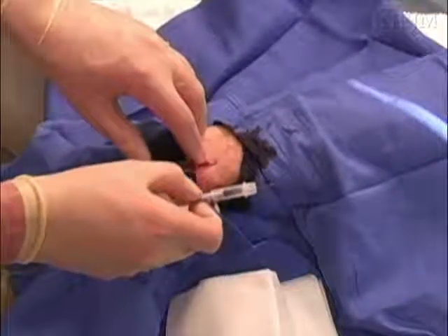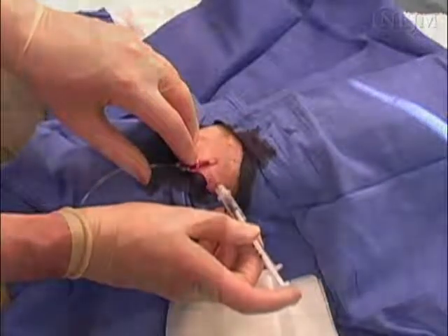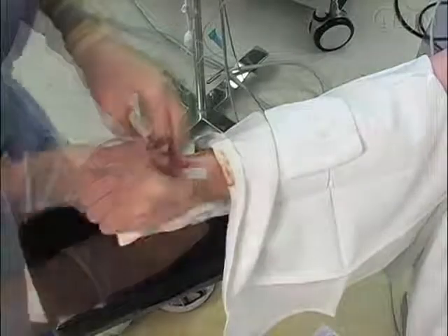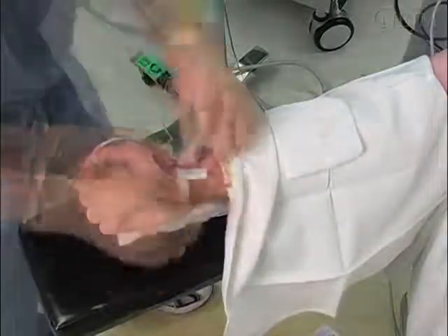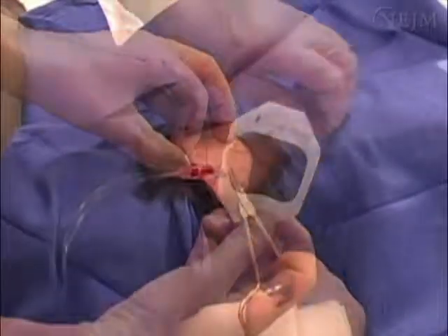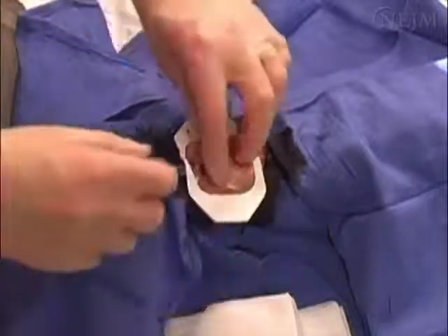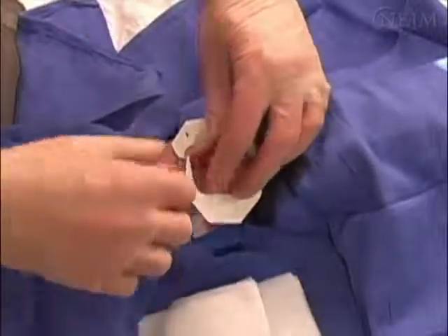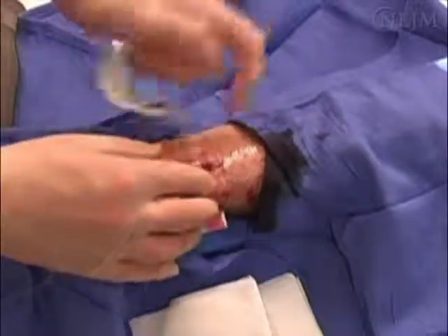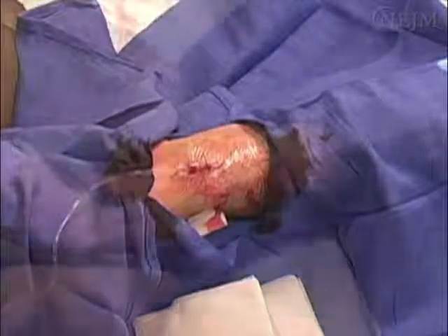Regardless of the technique used to place the catheter, great care should be taken to make sure it stays in place. Although there are ways to secure the catheter with adhesive tape, the best way to secure the catheter is by suturing it in place. A moderate diameter, non-absorbable suture material such as silk or nylon should be used. There are many ways to suture the catheter in place. The key is to make sure it is secure. A clear dressing can be placed over the catheter to help further secure it.